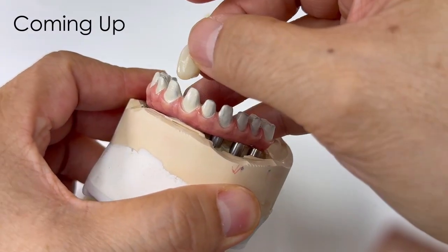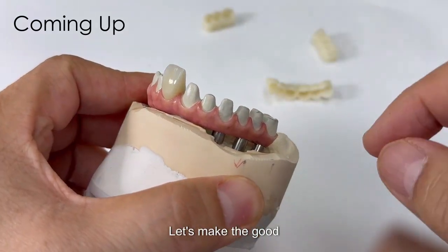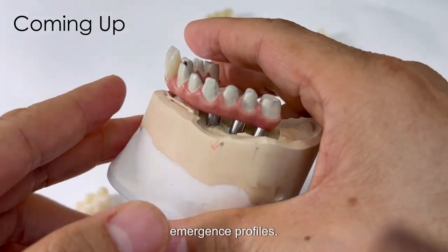It's like this. It's very good. Let's make the good emergence profiles.